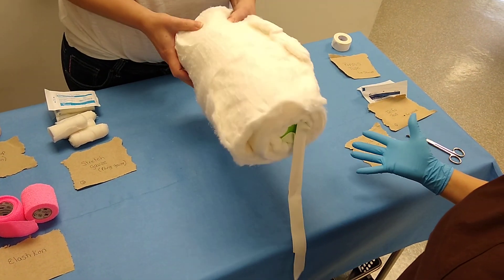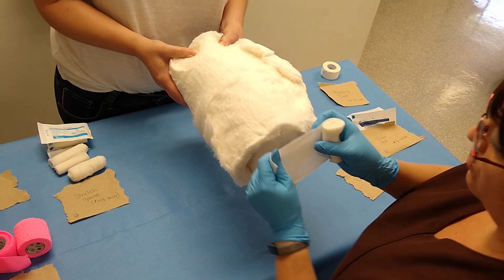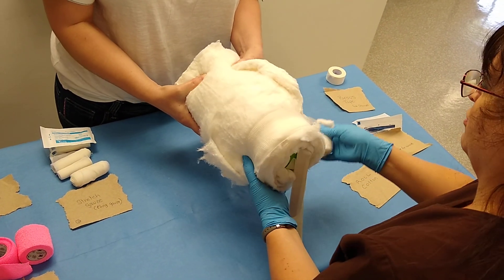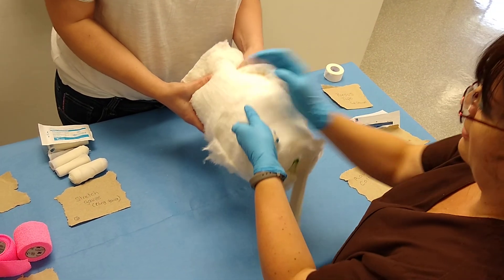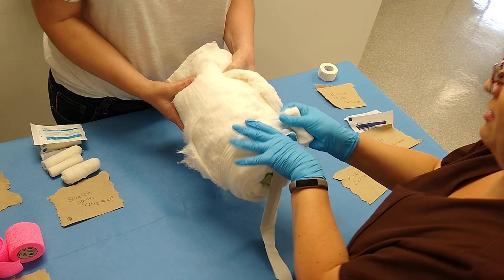It might seem a little excessive, but that's what you really want. We need to snug it down. Whereas you've been just making this snug so that you don't cut off circulation, the amount of roll cotton that you've placed in here will be the reason why you can snug this one down a lot tighter without cutting off circulation.